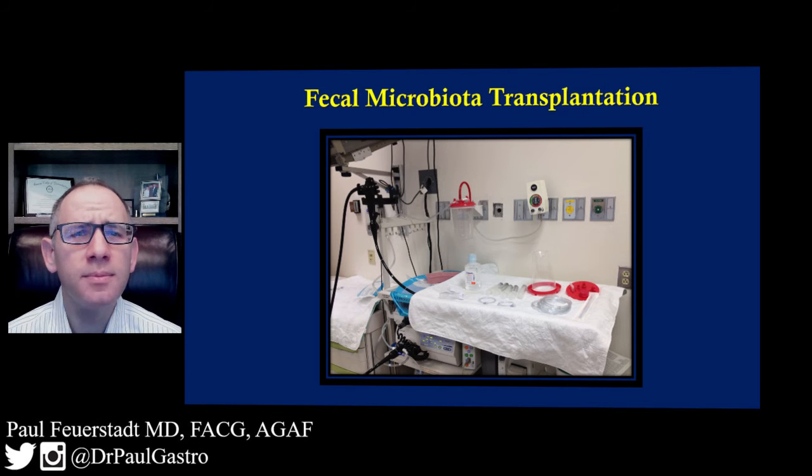Within the terminal ileum, 60 milliliters of the effluent is released. In the cecum, about 60 or 120 milliliters of the effluent is released. 60 milliliters is released into the ascending colon, 120 milliliters into the transverse colon. Prior to the procedure, Imodium is given.